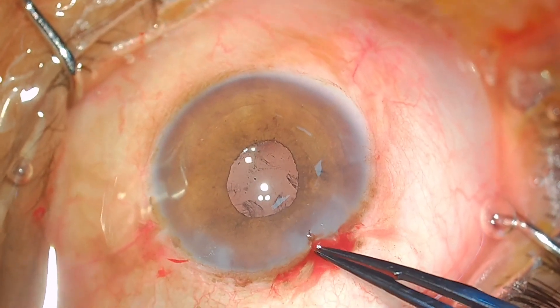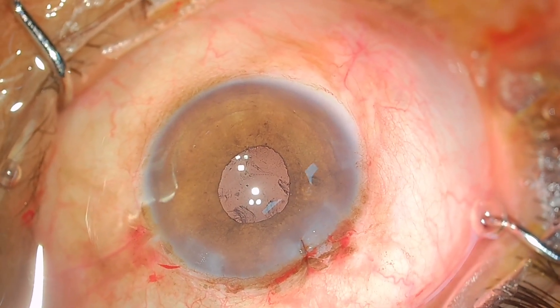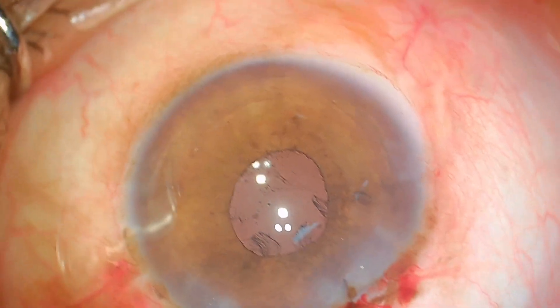I embed the suture knot into the cornea, and there you see a beautiful clear cornea with an intact posterior capsule.